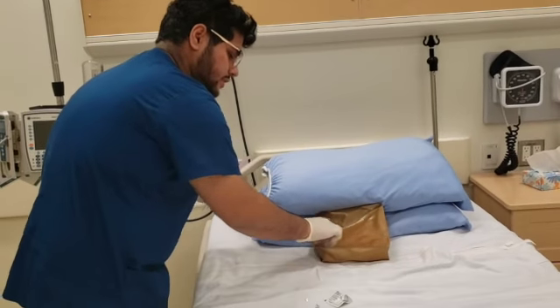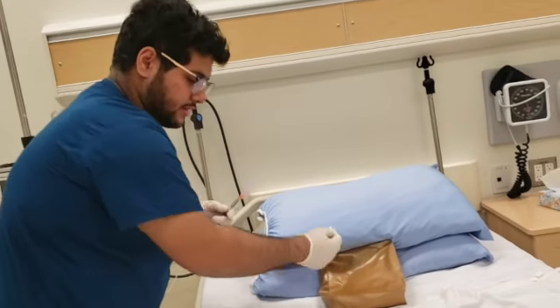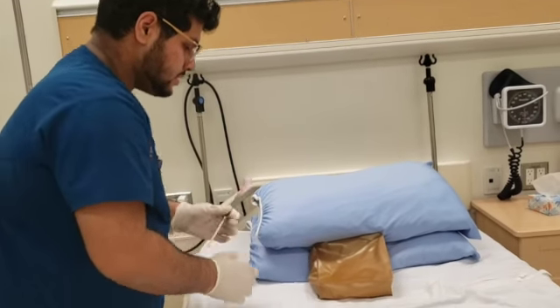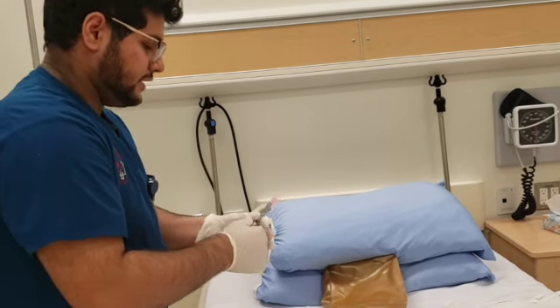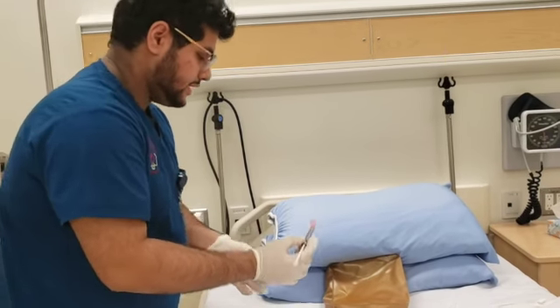We gotta leave it for long enough for it to dry. So we gotta make sure that the alcohol actually dries off. Keep this closed just in case we'll need it after we've given the injection. So now that the skin is dried off, I'll be taking my needle. This does not go in at a 90-degree angle. It goes in at more of a 45-degree angle because it's subcutaneous.